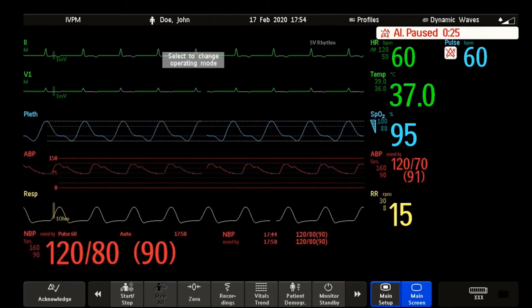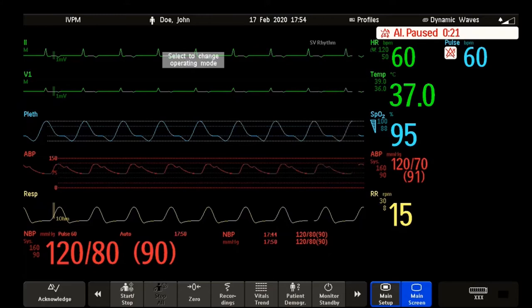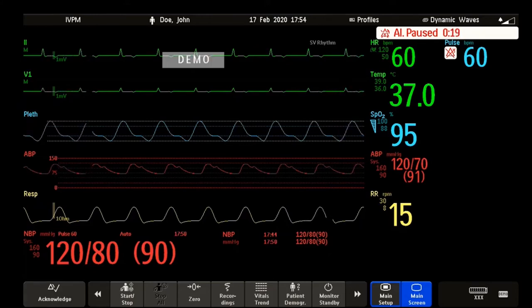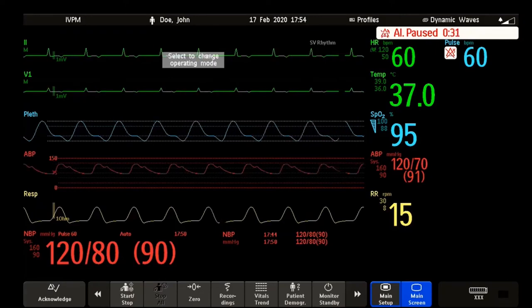Welcome to the Philips Intelliview Patient Monitoring Microlearnings. In this video, I will walk you through the basic operation of the Intelliview Patient Monitor. Let's get started.